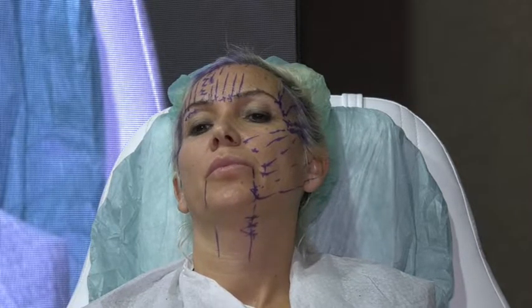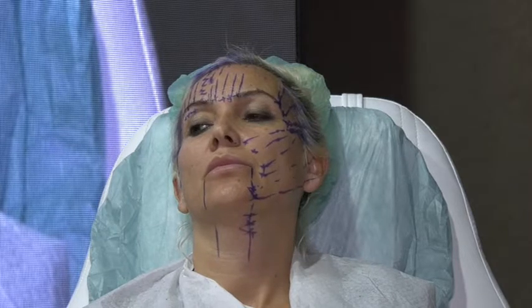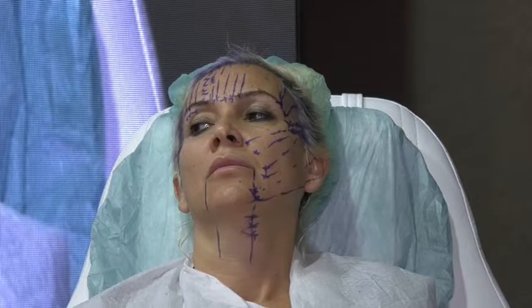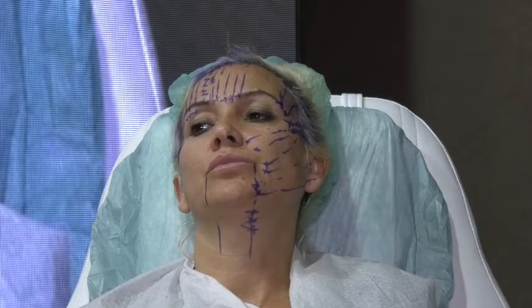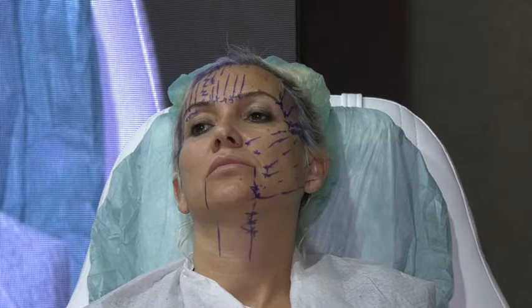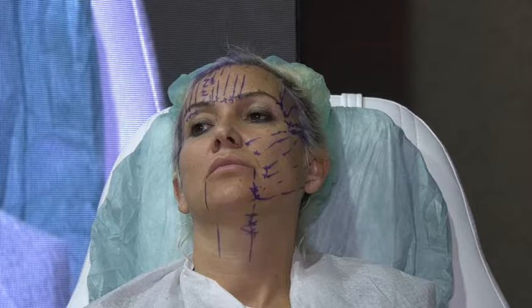What is this? Adam's apple? Hyoid bone. I sometimes go below, but I don't prefer to in the beginning, I mean the first 500 cases, to go below the hyoid bone, for many reasons. First, you have the thyroid here. You never know. If we do this line, it will come just above the thyroid. The second thing is this area is very loose and the fixation here is not easy, so the threads can go down and show here. So in the beginning, stay to the hyoid bone.